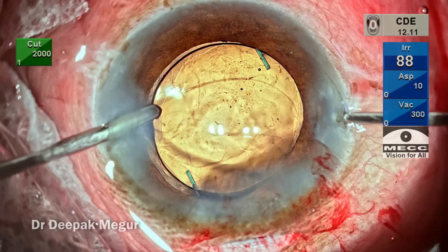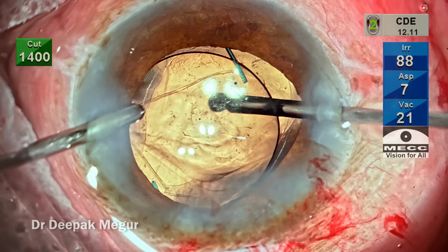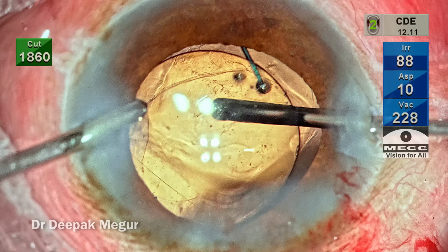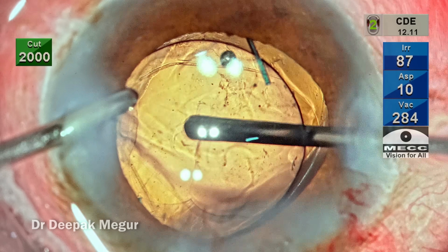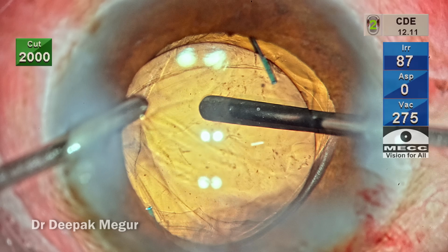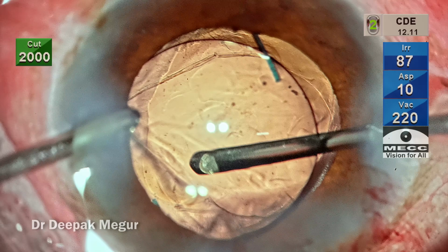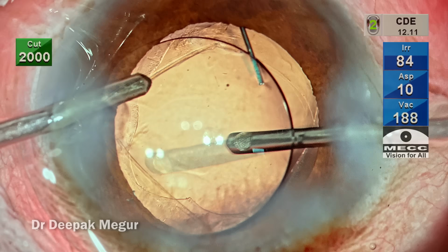Before we achieve optic capture, I would like to go ahead and remove all the OVD which has gone behind the lens and into the vitreous cavity. The irrigation is in my left hand, the cutter goes in through the right hand side port under the lens, and then in a couple of minutes the OVD which has been pumped into the vitreous cavity is all cleared off, along with some of the lens debris as well.